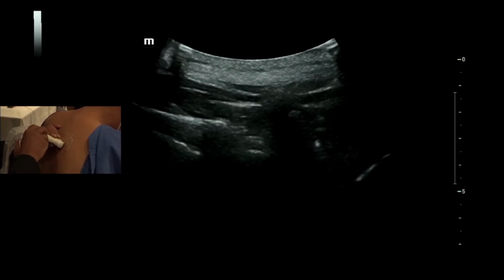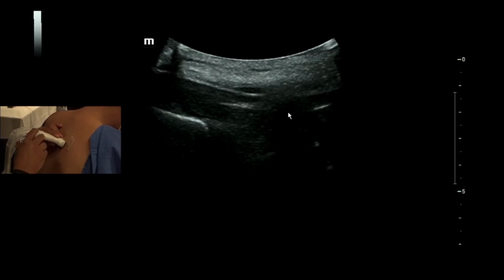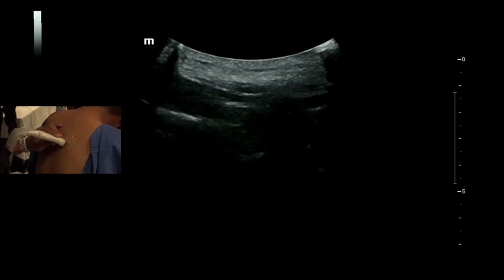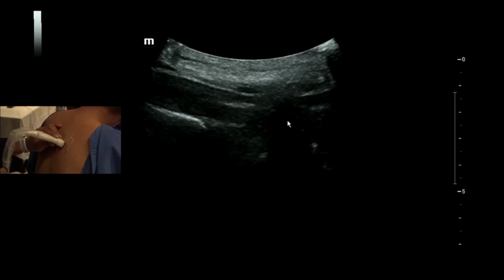Okay. So you have the spinous process. Now, when you look at this, you can see that there is a transverse process. Okay, can you freeze this image so that I don't have to keep holding it? Although I have quite strong hands.